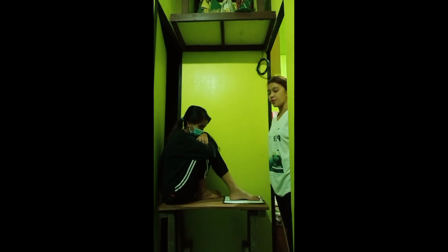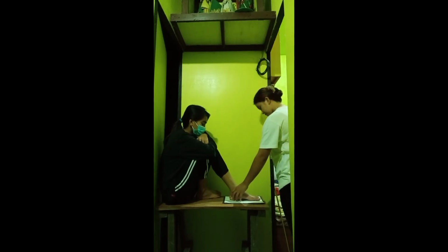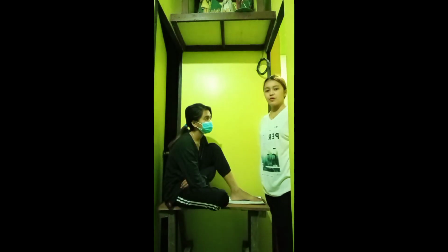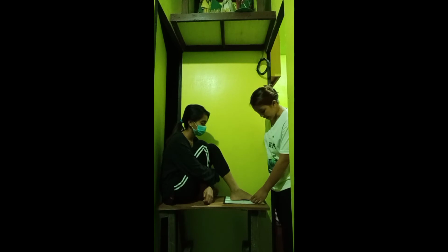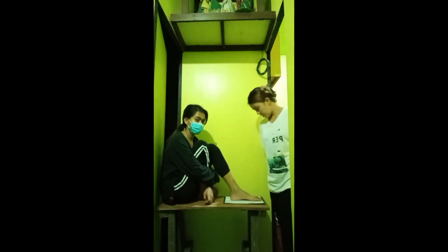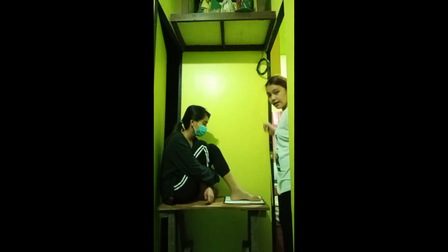Always remember that the primary marker is always on the right side of the image receptor, together with the secondary marker. As I said earlier, the knee of the patient is flexed, and the foot of the patient is in contact with the IR. The central ray must be perpendicularly directed at the base of the metatarsal.